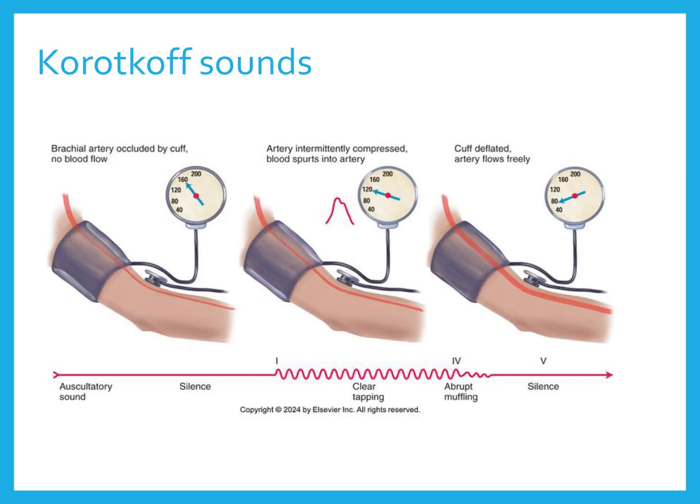Here's a visual example of how to take blood pressure by listening to the sounds. In the beginning, you're not going to hear anything. Then you slowly listen, and you'll start to hear it come in. That's your first sound, the very first one. We heard it here, so it would be 120. Then it becomes muffled, and then nothing. Right here is the last time we heard it, so that would be your last sound, and on the dial it says 80. So you want to make sure you're listening for the first one and the very last one, not when it starts to muffle, but when it stops.